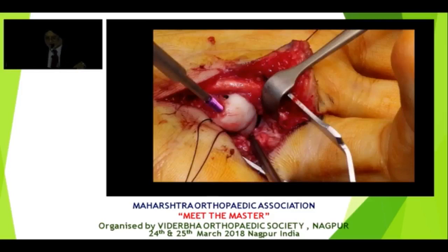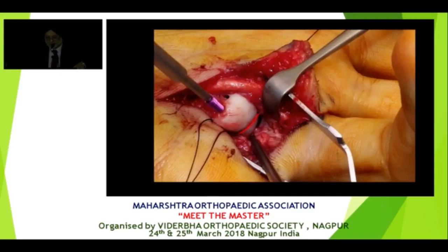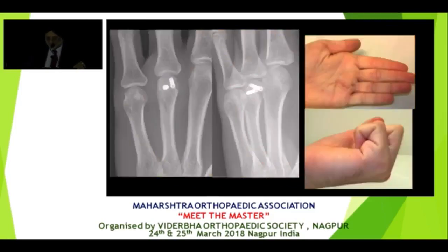So now we've hyperextended the finger so I can see the fracture line. And I'm putting two headless screws to stabilize that fracture. Right? So the concept again is small fragment to big fragment, lag screw. Here we're going through an articular surface, so we're using headless screws.